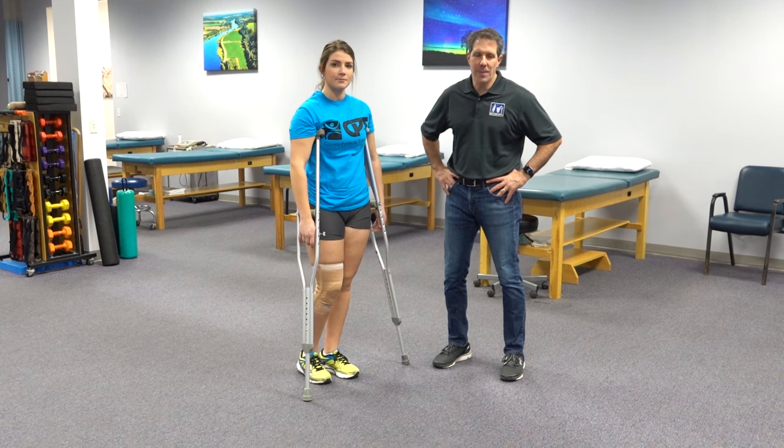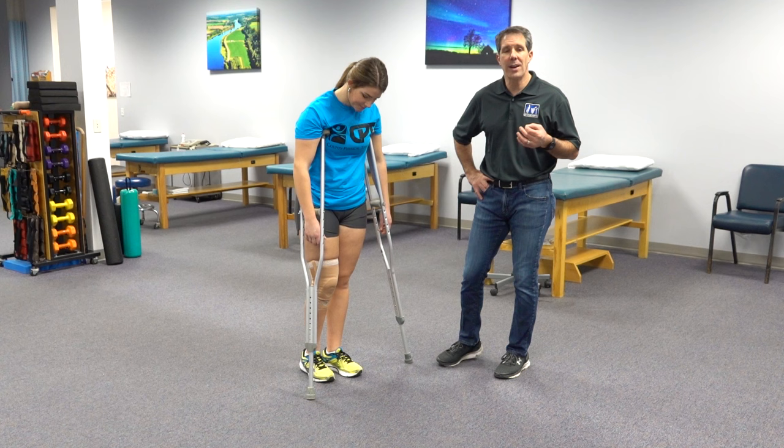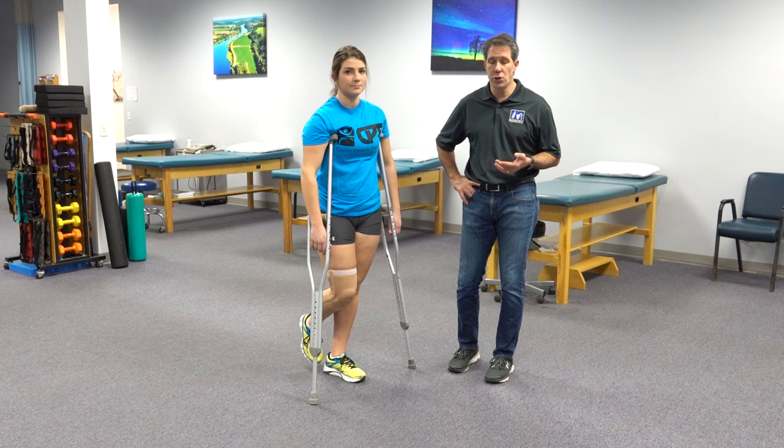Welcome back folks. Today I want to talk about how to use your crutches when you are having a non-weight bearing status. So if your orthopedic surgeon or your primary care provider tells you you should not be putting any weight on your leg, then this is how you are going to do it.